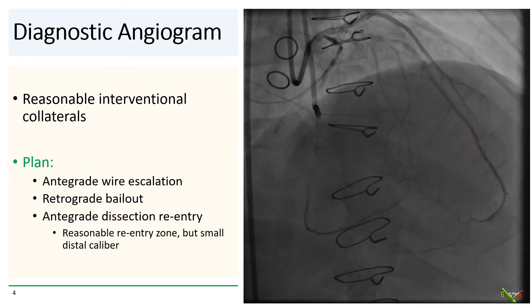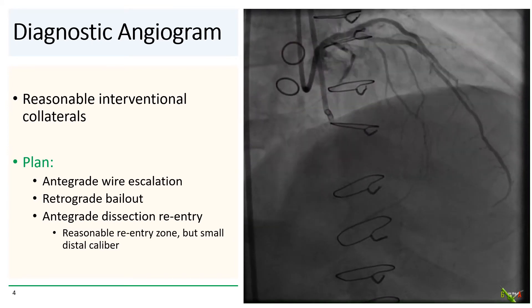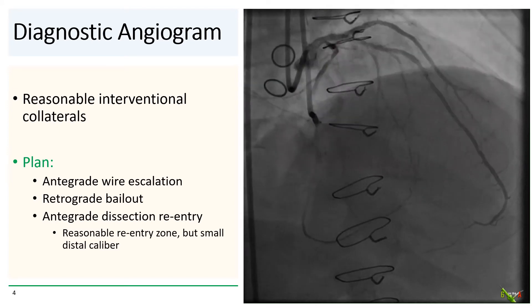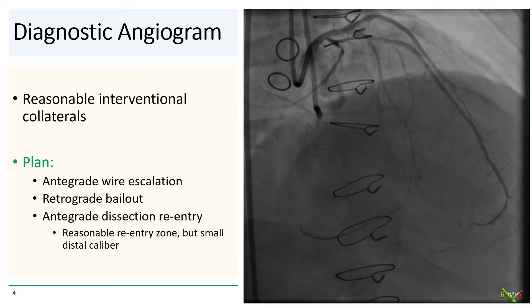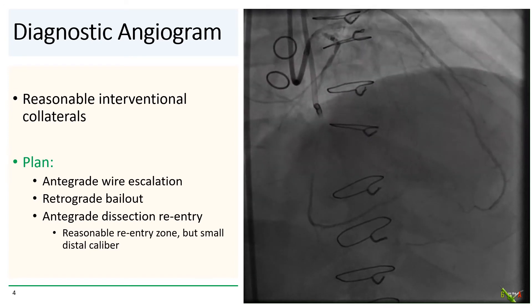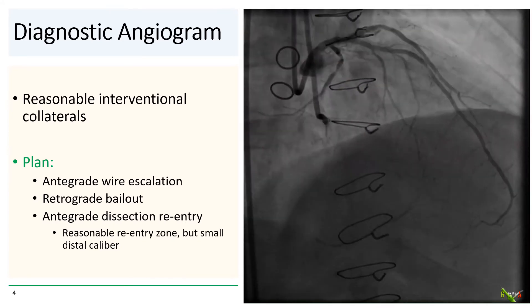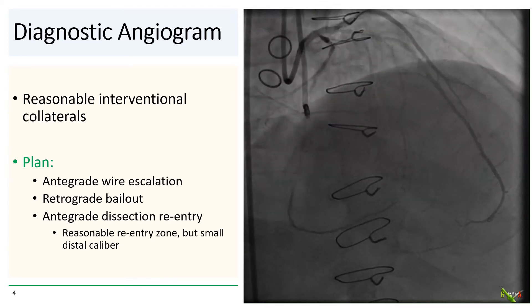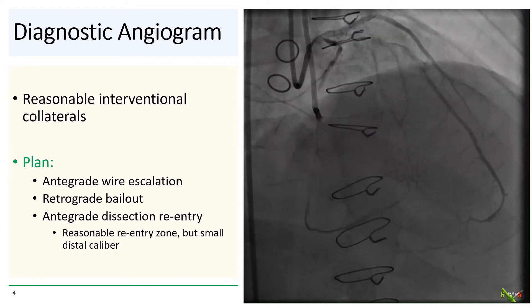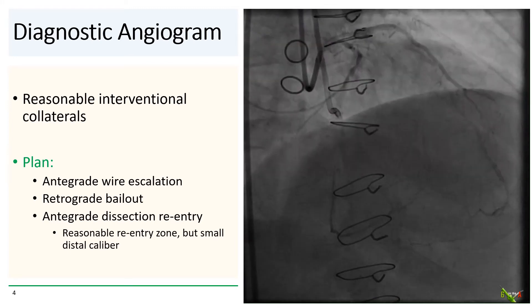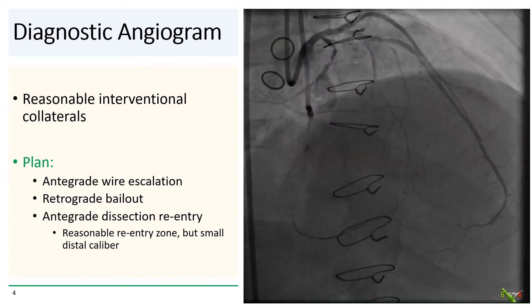In the contralateral view, we see that there are several reasonable septal interventional collaterals that could be used. Our plan was to first start out with a regular antegrade wiring strategy and then switch over to retrograde if that fails. We do typically start with antegrade in nearly all CTO PCI cases since you never know if you might just get lucky and cross.